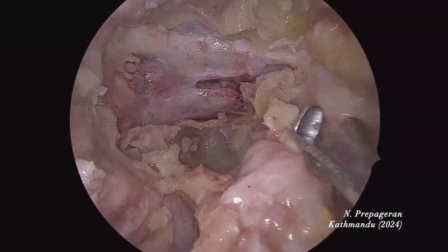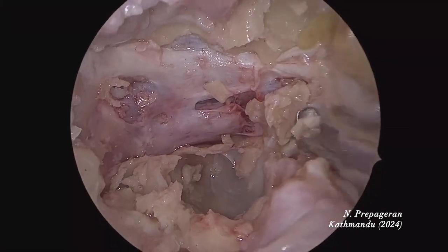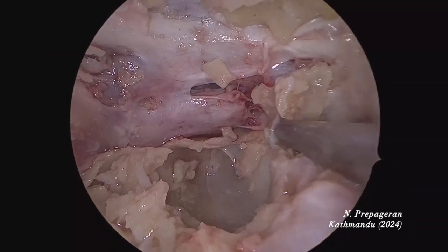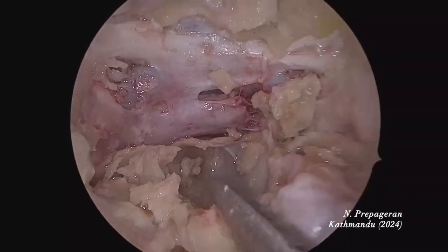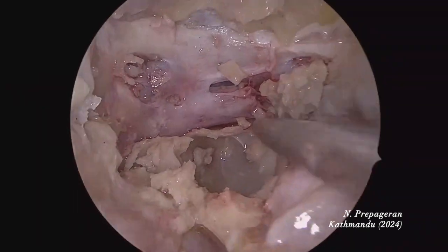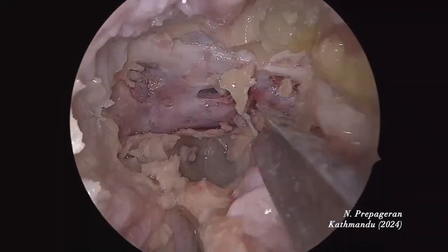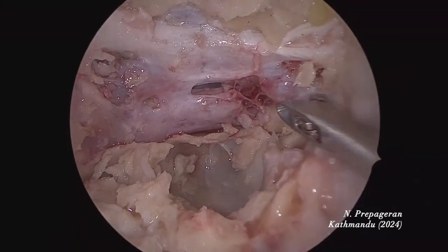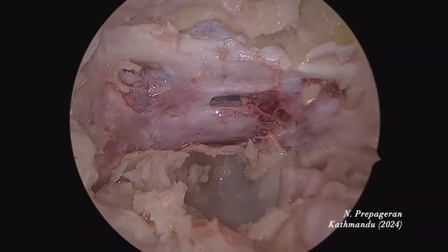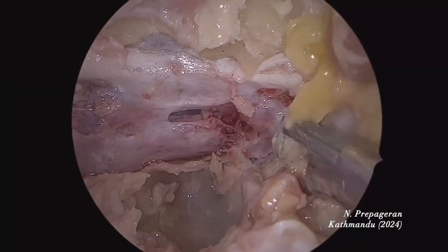I can just cut this and punch it. Be careful when you bang — do it gently. R3 is now exposed. That is the optic-carotid recess there. I want to make sure there's enough exposure before I open the dura. We've opened and exposed the cavernous sinus on both sides. I want to make sure we have exposure to Meckel's cave. This is not an easy sphenoid — thick bone. Orbital apex.